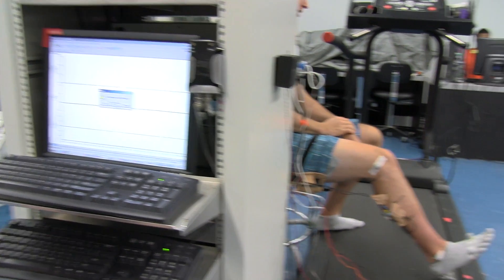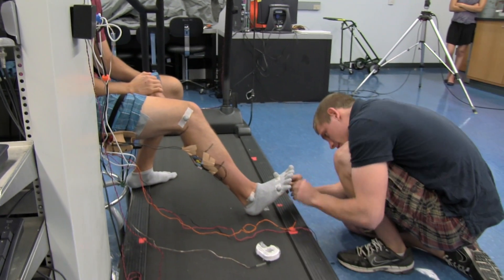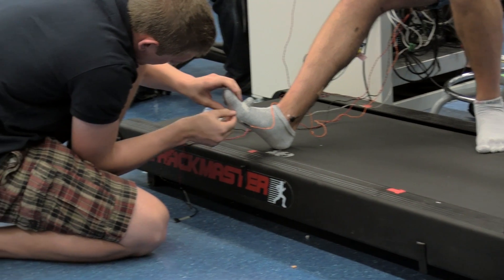And so that's our pressure sensors, we put those inside of these special socks. It gives us the pressure sensing data we have up here.